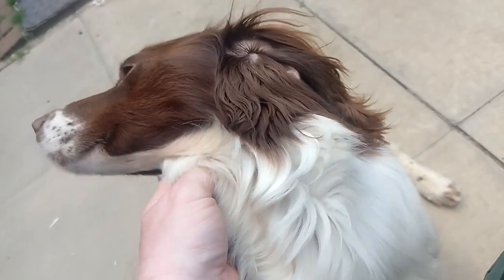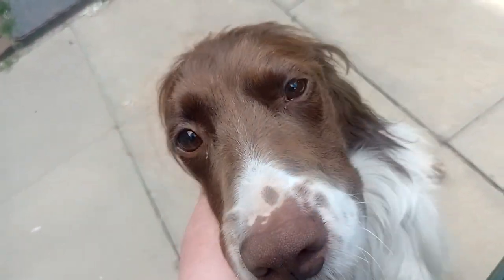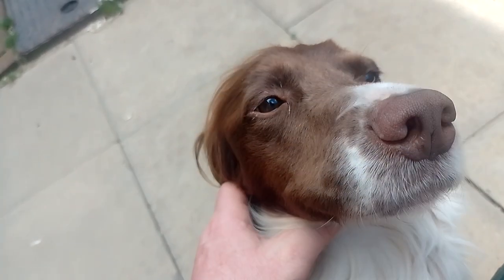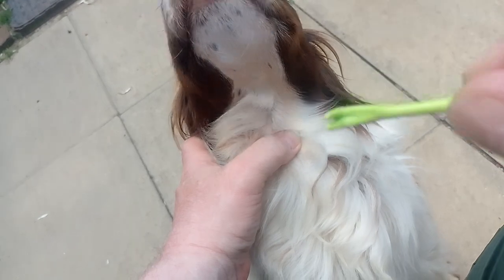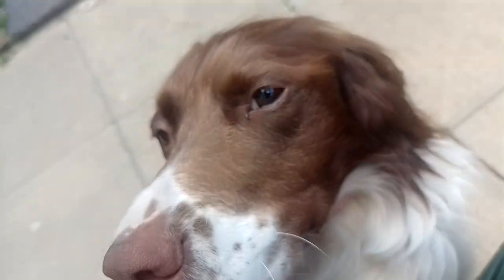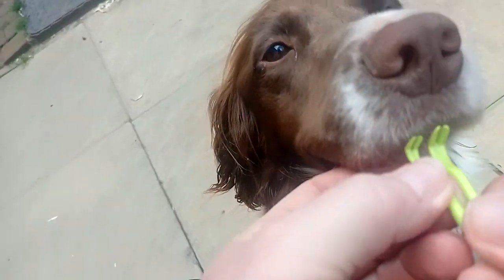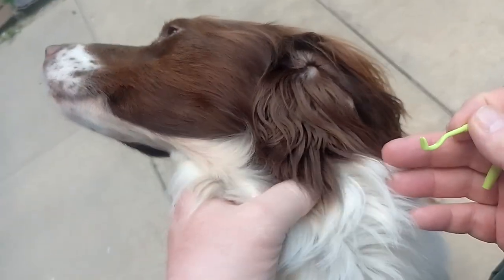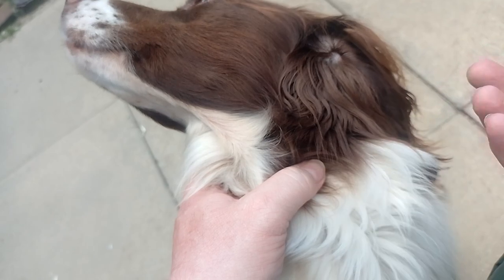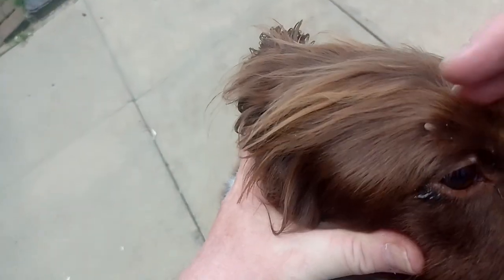It's hard for me because the dogs are used in undergrowth. These are the tools I use to remove them — there's one and there's the other. Two sizes, one smaller than the other. You've got to judge by looking at the size of the tick which tool to use — small tool or large tool.